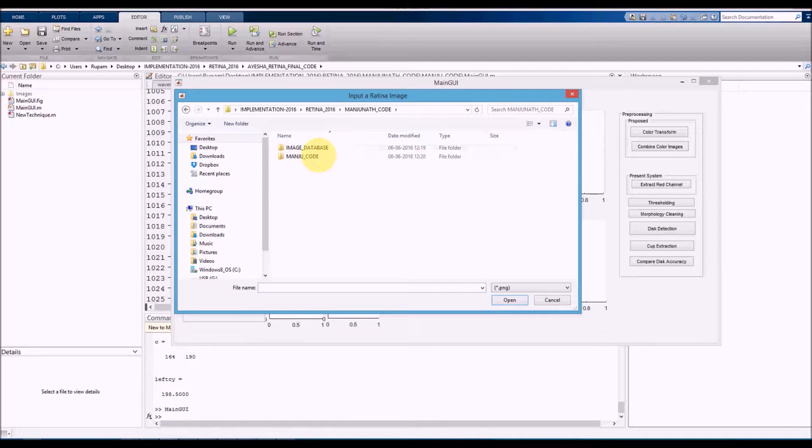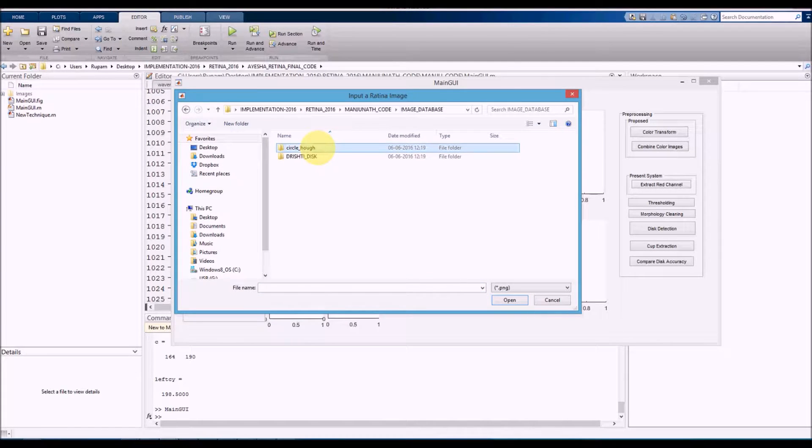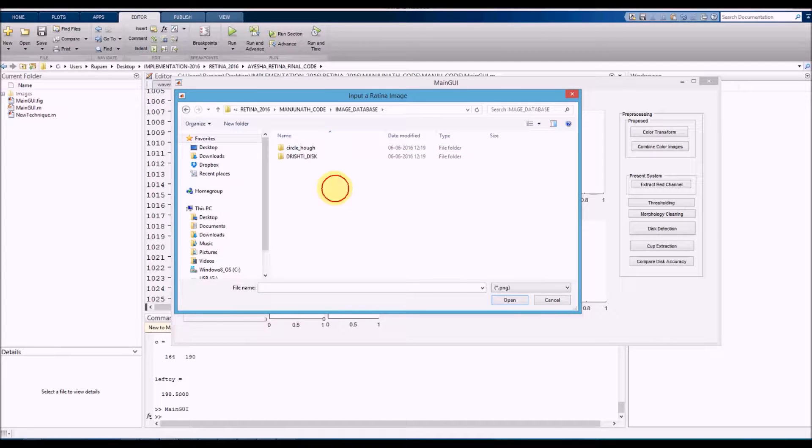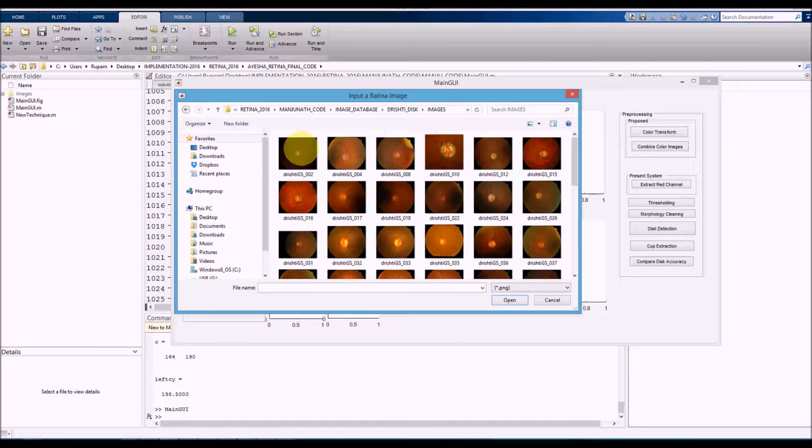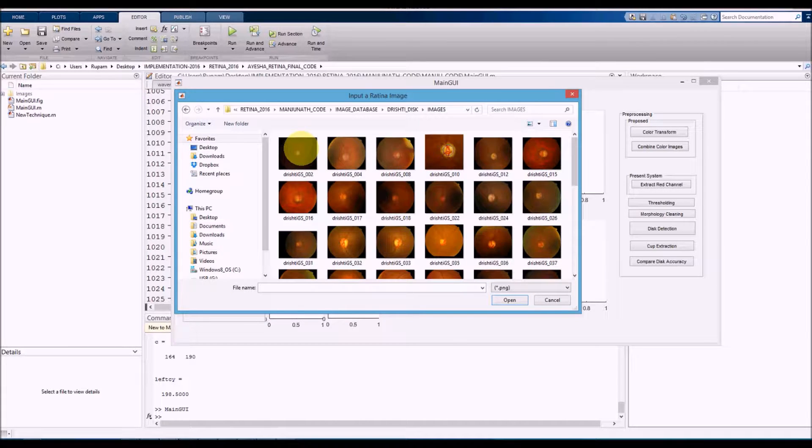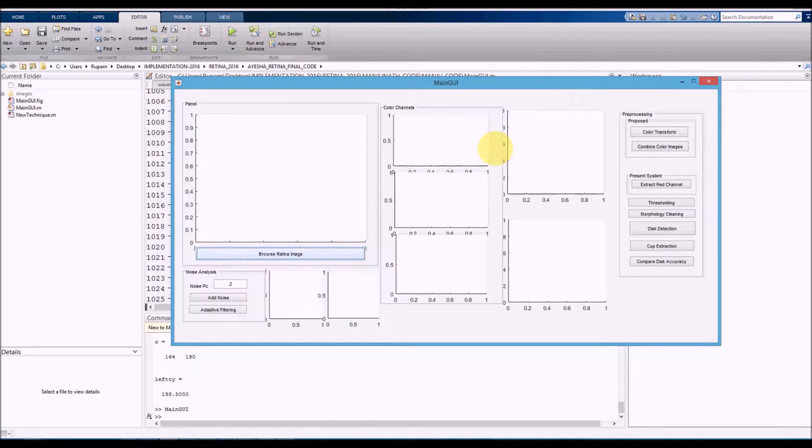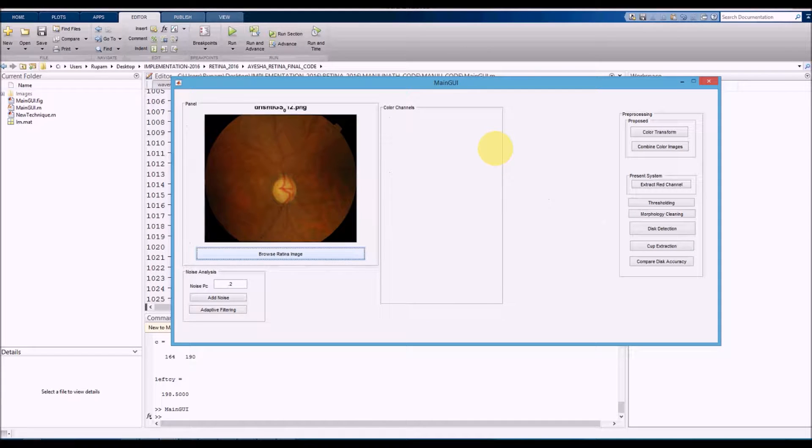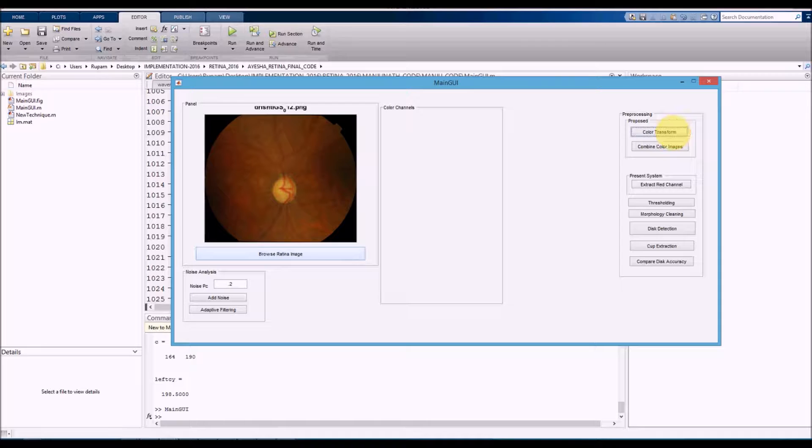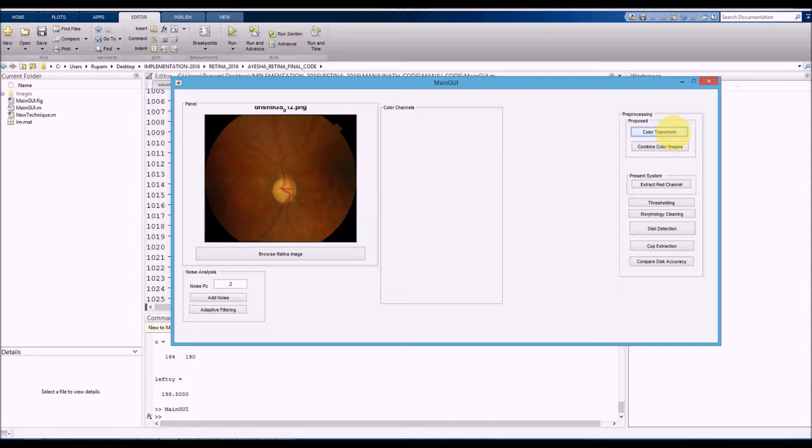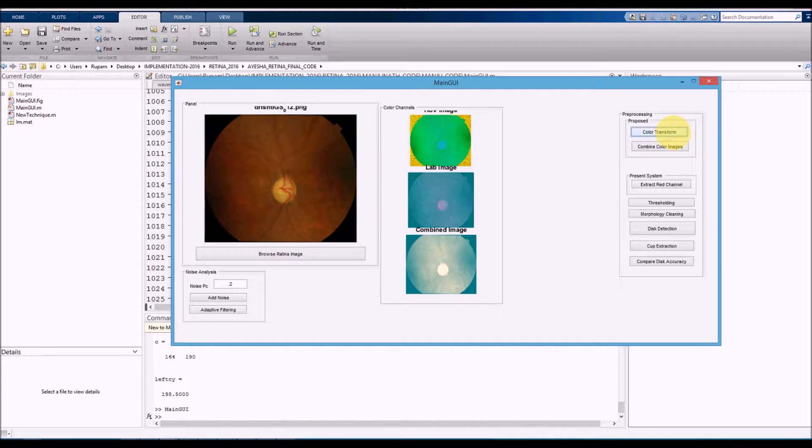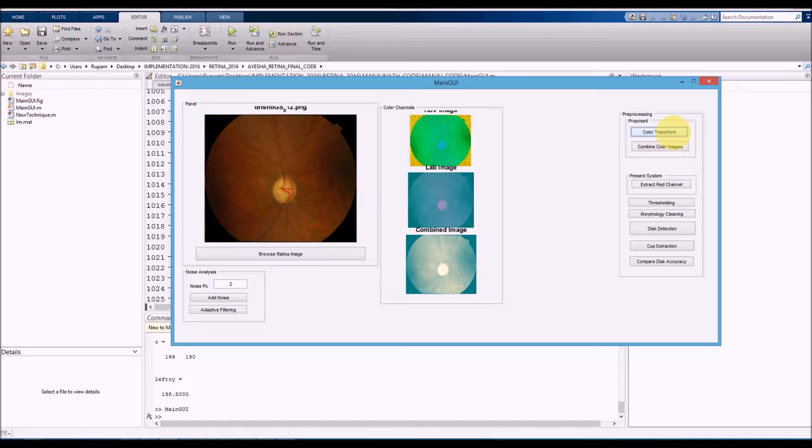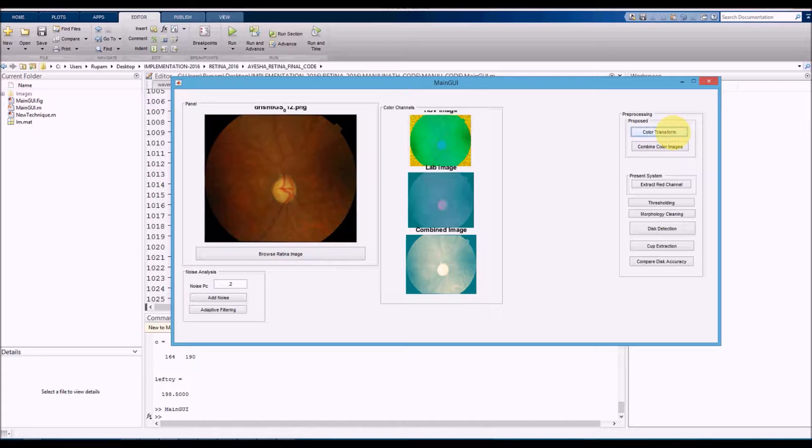We go to the image database and select image number 12. Color transform converts the image into LAB color space and HSB color space. We have this RGB color space, and we can see LAB color space and HSB color space.